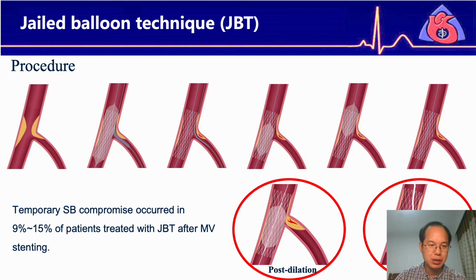However, sometimes side branch occlusion will occur, mostly in two circumstances. The first is at the stage of post-dilation. The second is at the stage of side branch rewiring.